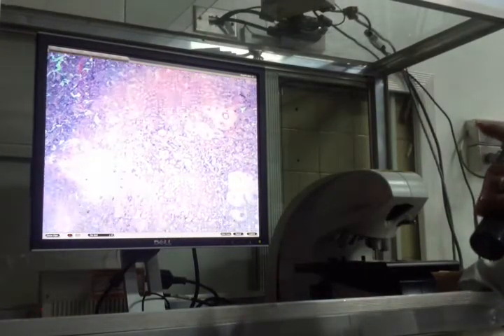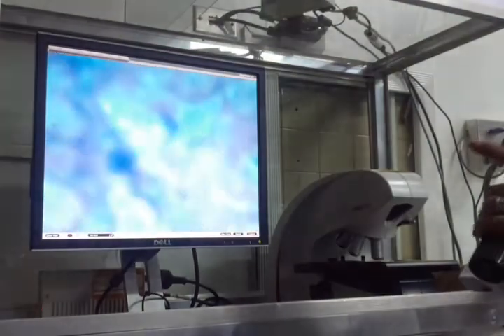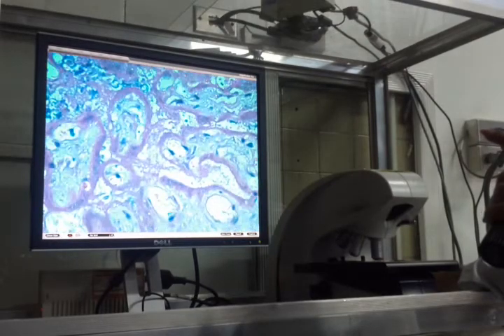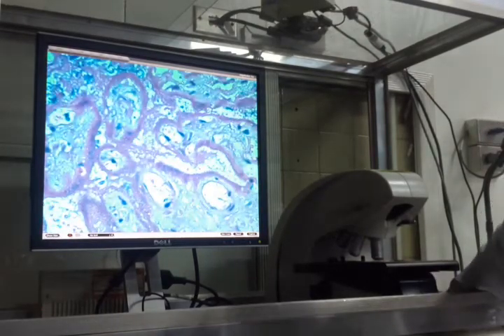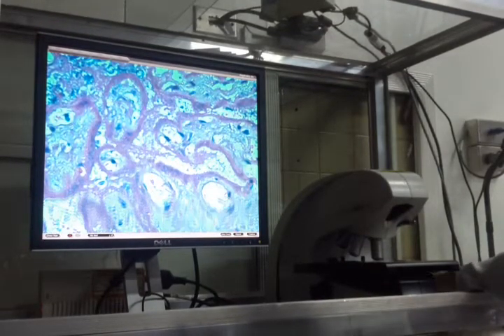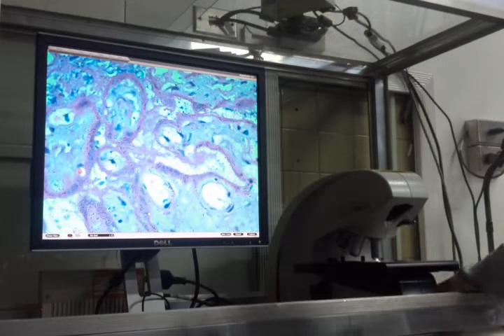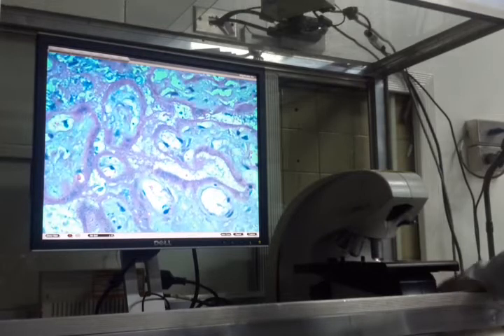However, this can be focused to you. These structures are also chorionic villi. Tama? But all you can see now are fibroblasts. They're the only ones living.